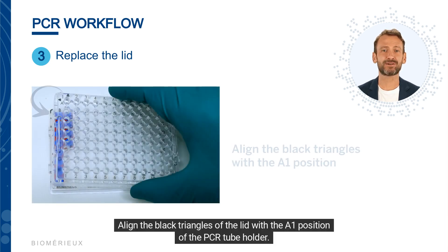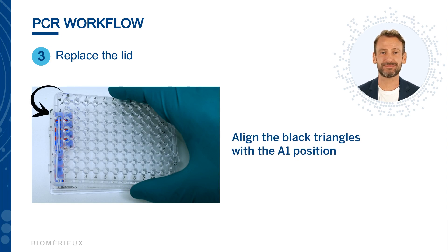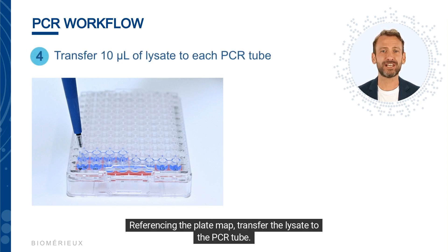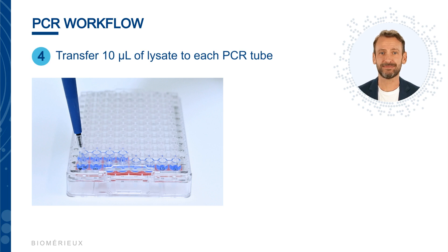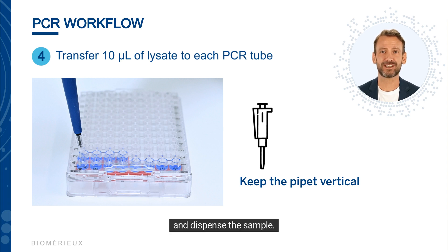Line the black triangles of the lid with the A1 position of the PCR tube holder. Using the GeneUp tips, aspirate 10 microliters of lysate. Referencing the plate map, transfer the lysate to the PCR tube. Keeping the pipette vertical, insert the pipette tip through the lid of the PCR tube holder and the septum cap, and dispense the sample.